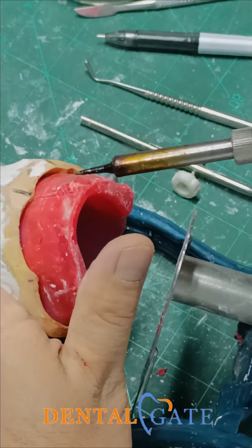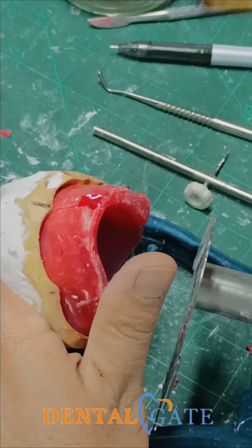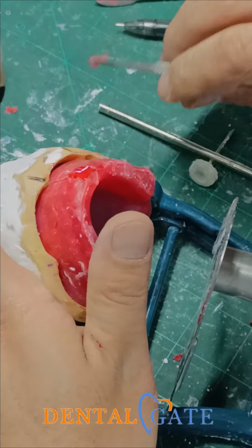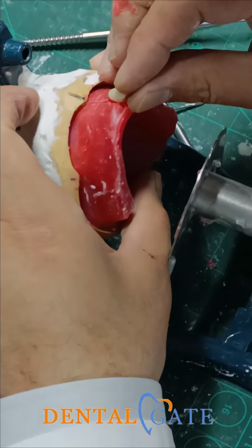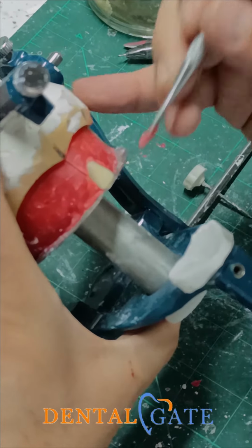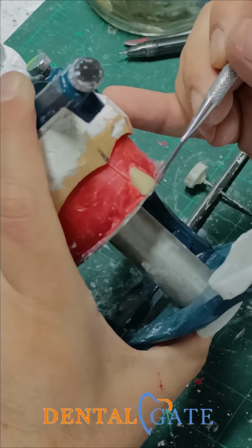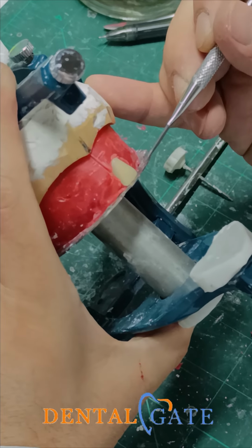Now make a molding here to prepare the position of the central incisor. Make an initial check regarding the attachment of the incisal to the table. This is very necessary. But for the lateral, you can make it within one level.